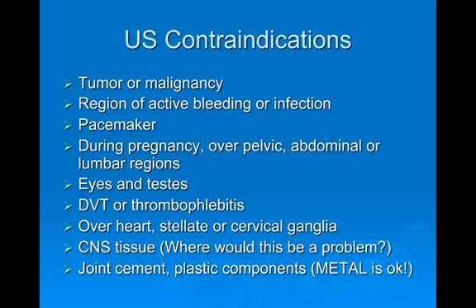The problem comes in with doing it over more recent sorts of prosthesis, which are using more plastic and more and more cement. All right, so on one hand, we probably don't get anywhere near the temperature increase at the depth, let's say, of a total hip that you're going to affect this joint cement. But people have done studies where they've used ultrasound and heated things up to where they were able to make some of the cement come loose and melt some of the plastic components.